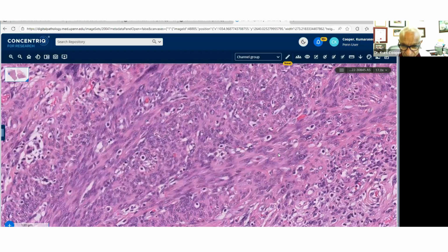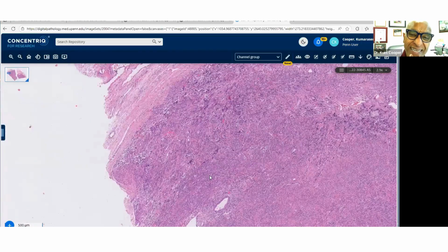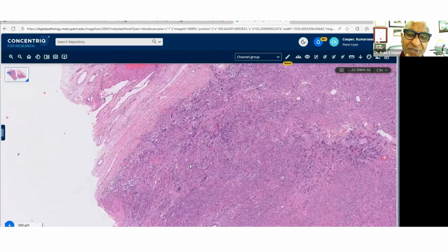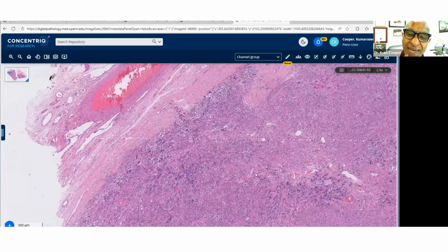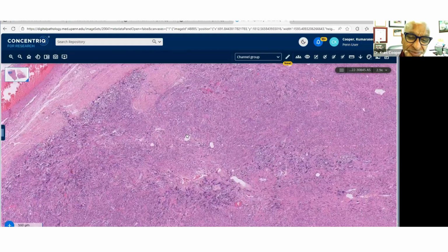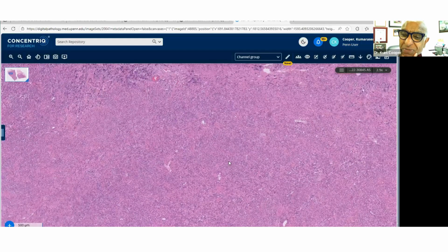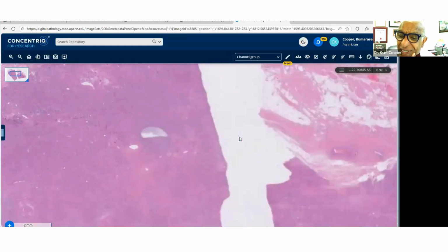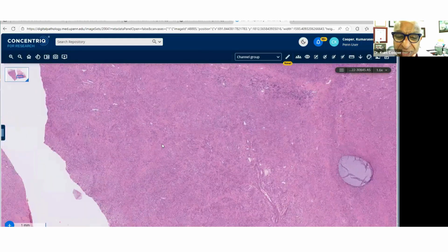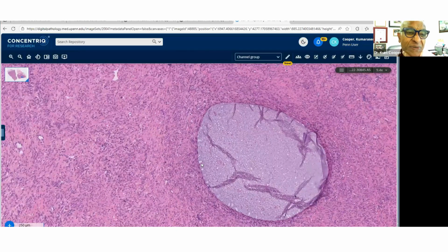So, I think the morphology and the immuno supports that. I was very happy and confident, and the clinicians were happy it was benign. So it was just follow up and nothing, no other modalities of treatment required. There's one here with a bit of mucinous material in it. Yeah, it's more attenuated. Okay.